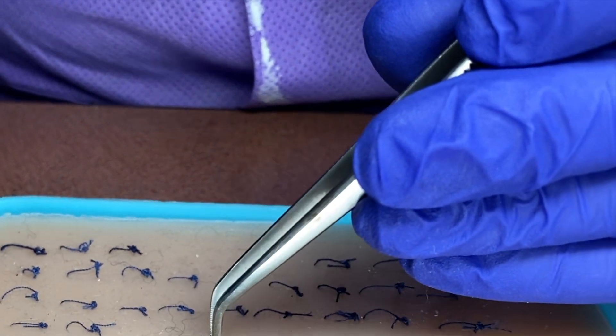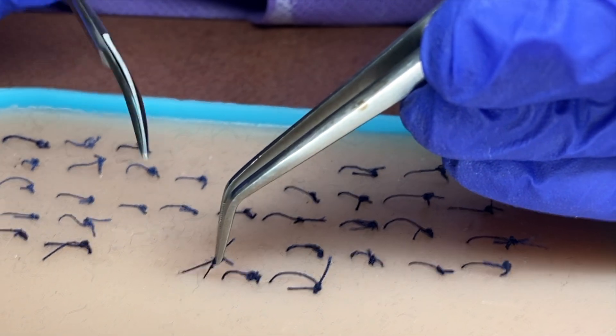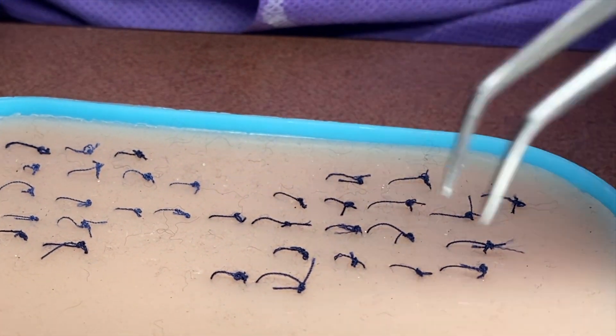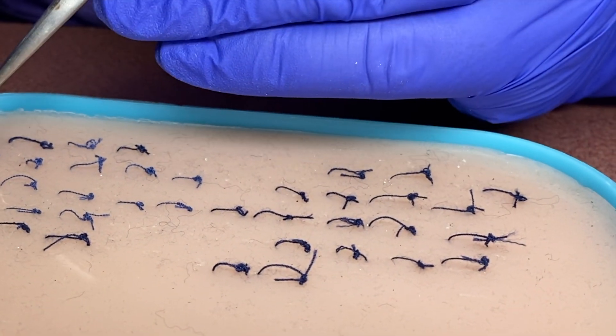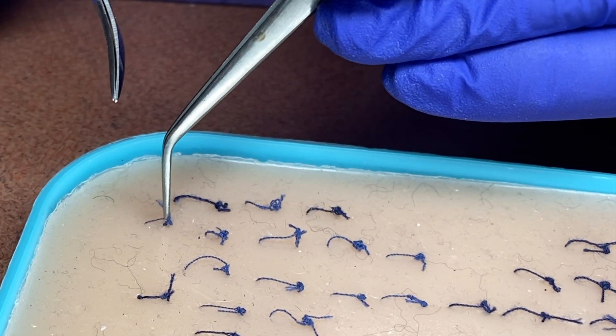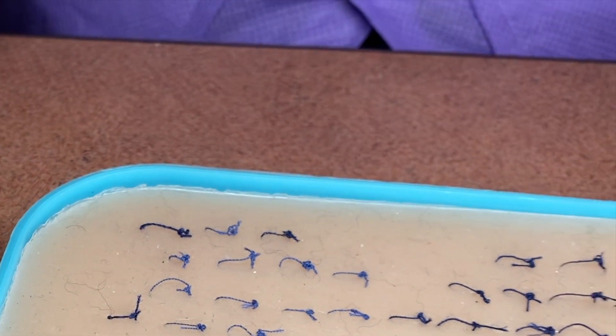If the suture is still extremely tight, we'll evaluate that — cut gently and remove. If you can't get the suture off the tissue, we would then get the doctor to come in and apply anesthesia to remove that suture from the patient. And there you have it.